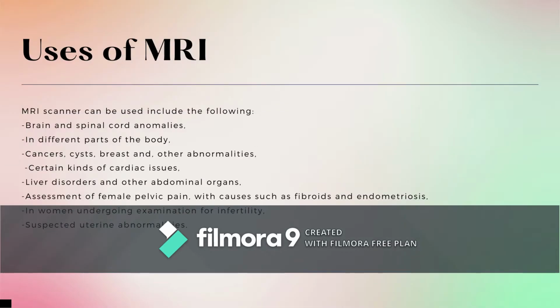An MRI scan, since it does not use potentially harmful ionizing radiation, differs from CT scans and X-rays. The invention of the MRI scan is a significant breakthrough for the medical field, a non-invasive instrument. Physicians, scientists, and researchers are now able to explore the inside of the human body in great detail.